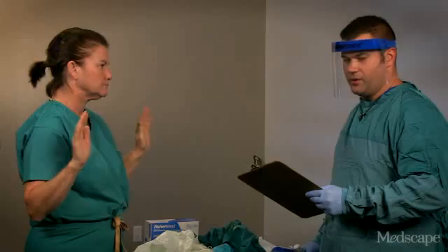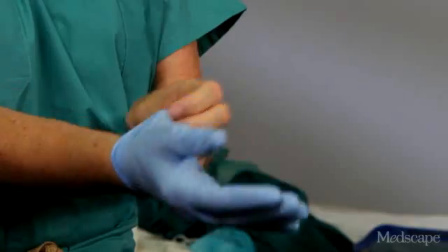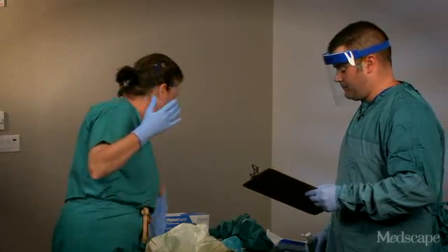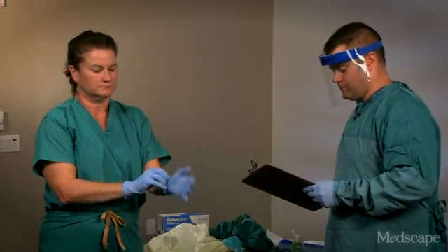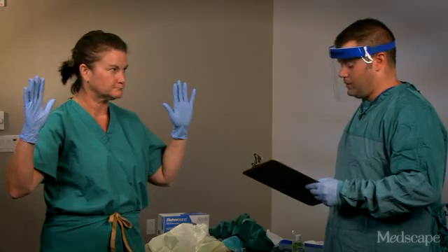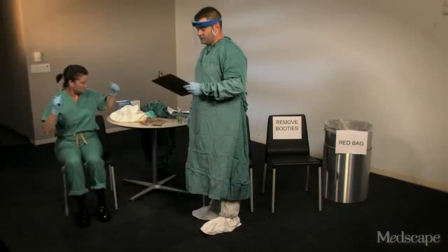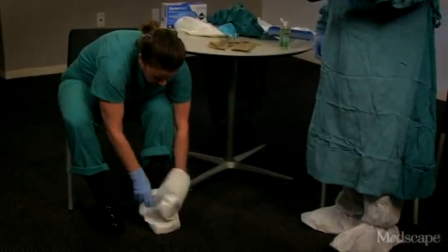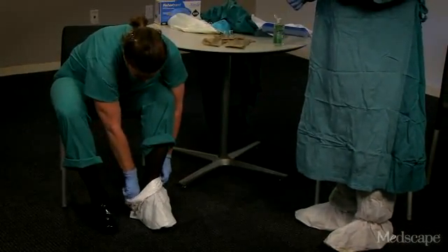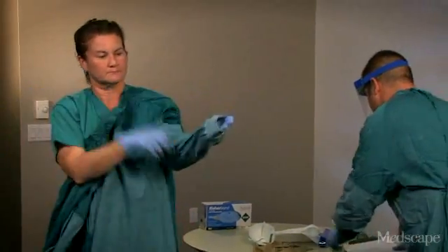Then she's going to put on the first pair of gloves after ensuring her hands are dry. Next, she's going to sit in a clean chair and put on the shoe covers and pull them up to her mid-calf. Barbara is now going to put on the gown and make sure the inner gloves are tucked under the sleeves of the gown.